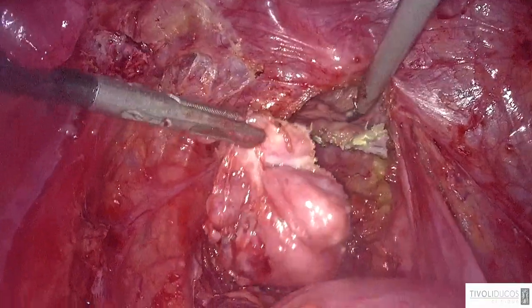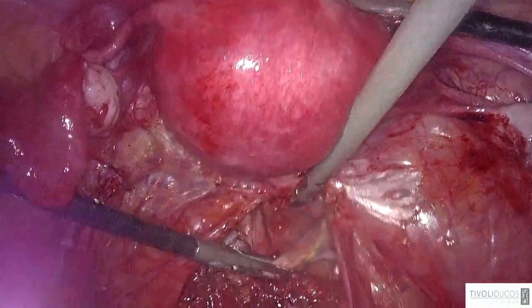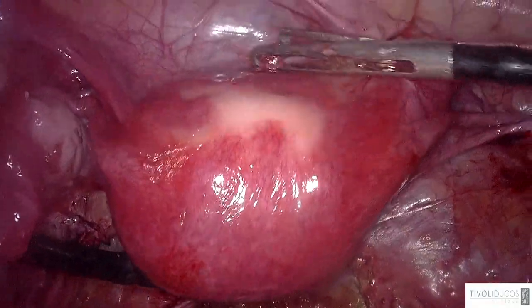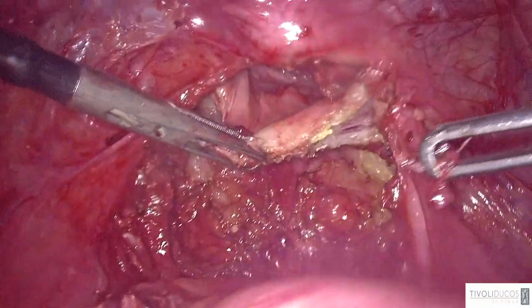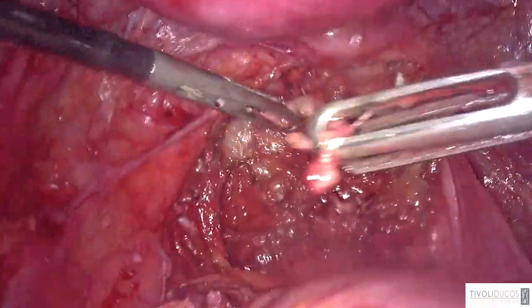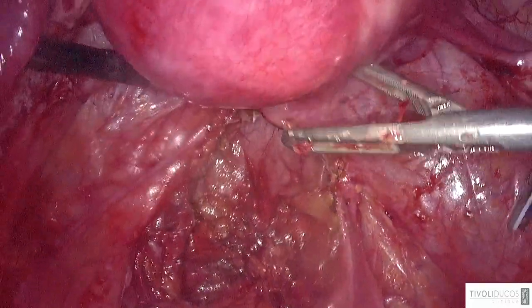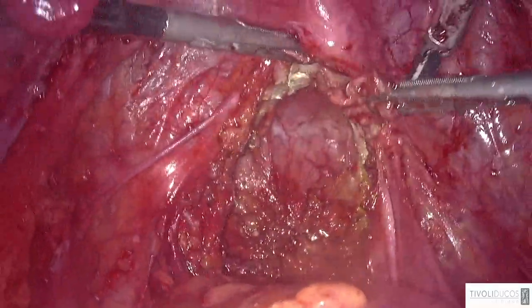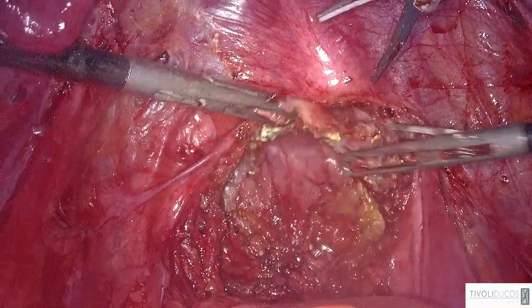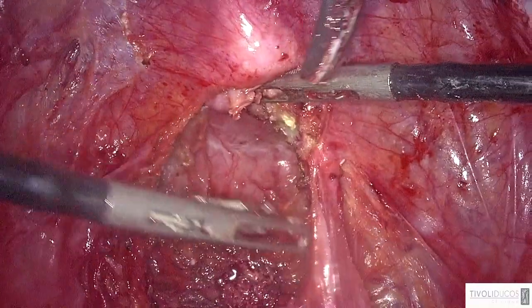Yeah. No photo, no, thanks. So we have a very big hole into the vagina, and we'll close it a bit later. So the vaginal part is completed, huh? Yeah, it is completely open. No nodule on the right side, on the left side, nothing, huh? Yeah. Okay. I am going from the left side to the right side, like this. Hold this. Now we have some endometriosis here.